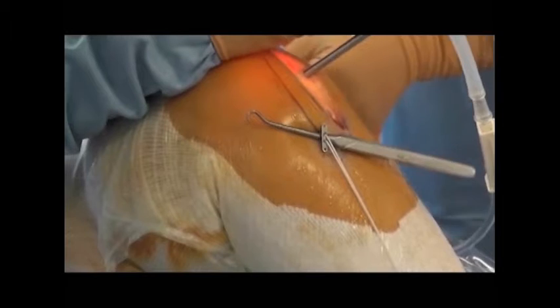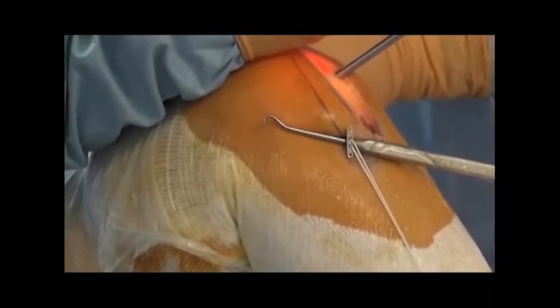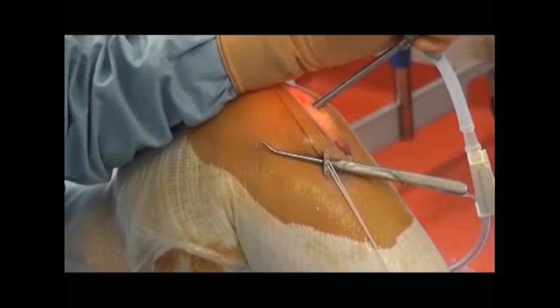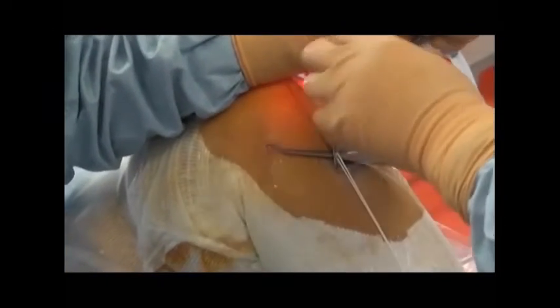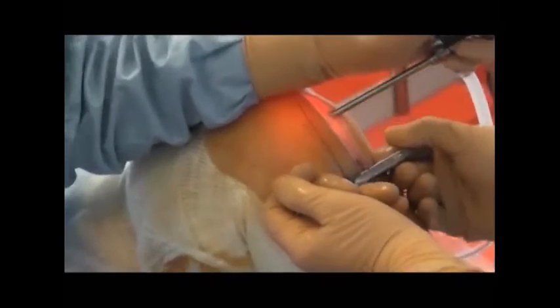Lock the fixation in place on the femoral end. With the knee flexed, alternately pull on the white threads of the implant until they lock into place. Check that the construct is stable by pulling on the graft.